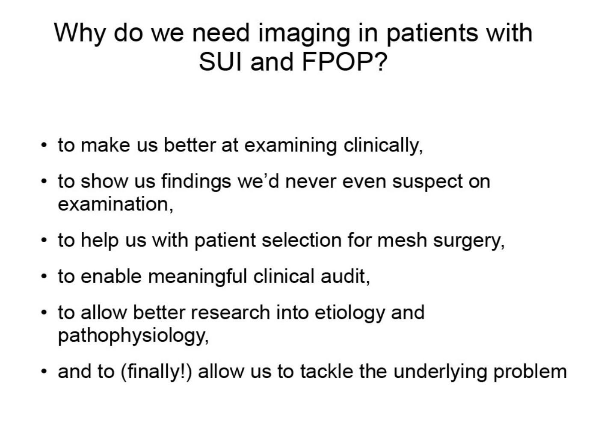If we want to fix symptoms of obstructed defecation, we need to fix the pocket. If we want to fix a prolapse, well, the first thing is not to fix a questionnaire, for God's sake. The first thing is to fix the anatomical abnormality. And then there's research into etiology and pathophysiology, and I really don't need to make the point because up to this point at this meeting there have been between 25 and 30 papers that used ultrasound measures as primary outcome measures. So obviously people realize that it's a very useful tool for research.